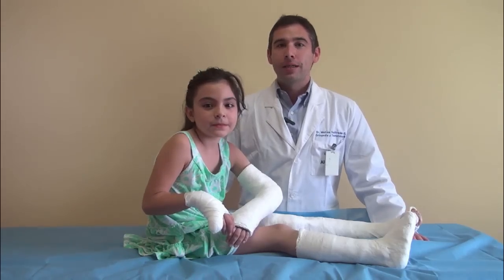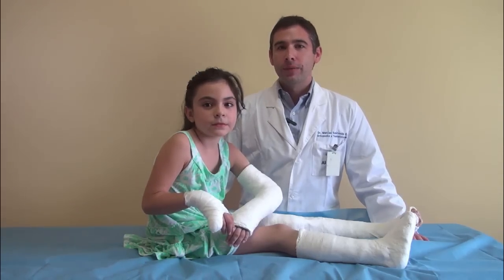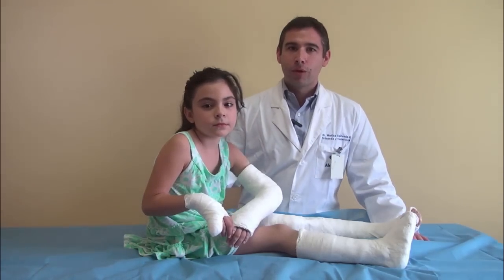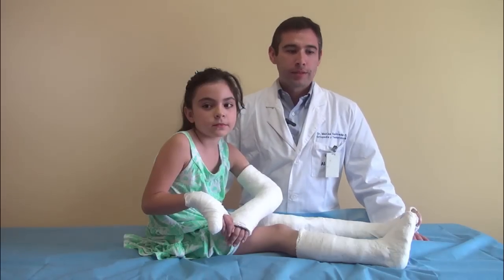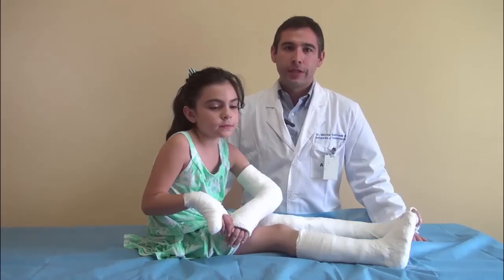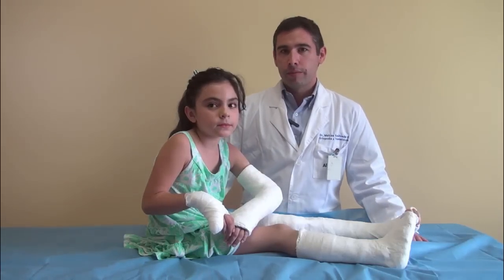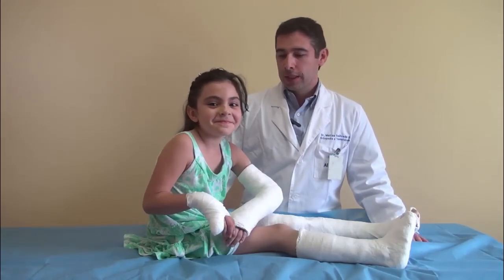I'm Matias Sepúlveda, orthopedic surgeon from Chile. We're here with Micaela, our model. We're going to show you some different types of immobilizations that we use mainly in trauma practice.